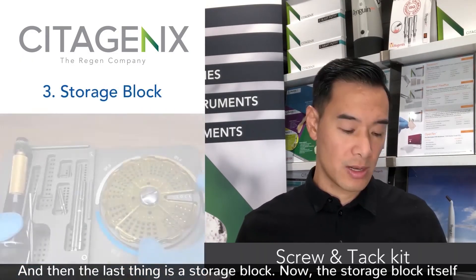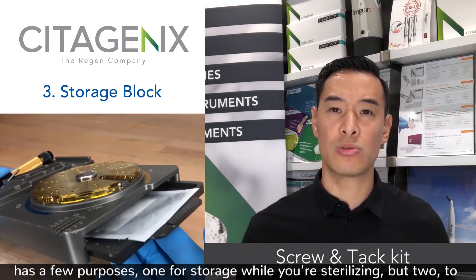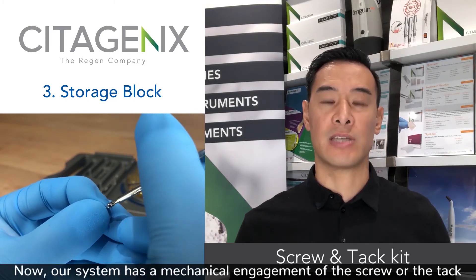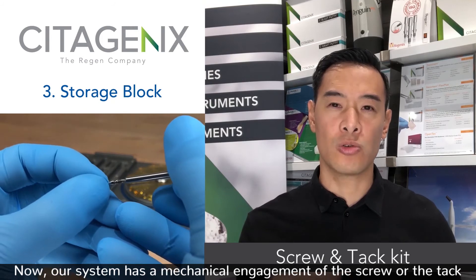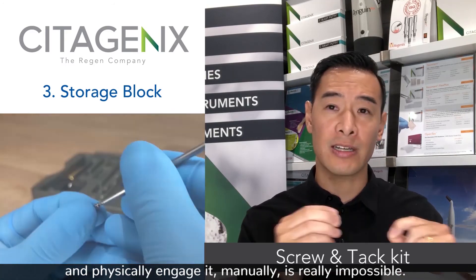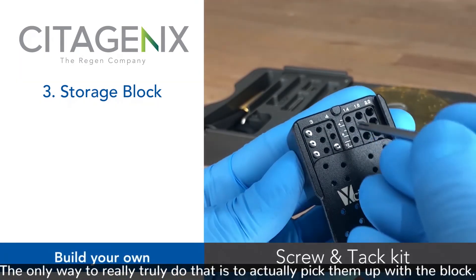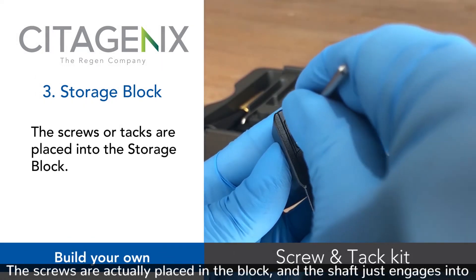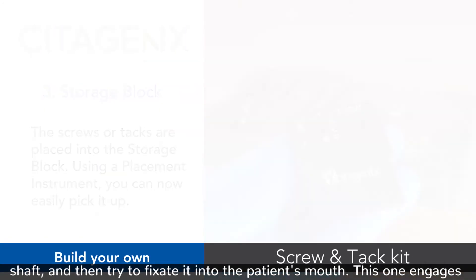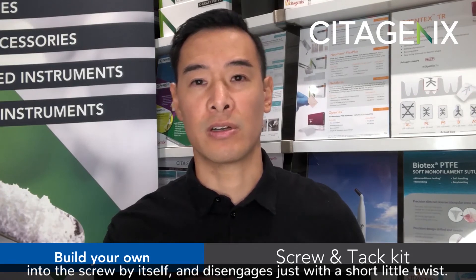The last thing is a storage block. The storage block has a few purposes: one for storage during sterilization, and two to pick up the screws or tacks in the middle of surgery. Our system has a mechanical engagement of the screw or tack, because trying to pick up a tack with your gloves in the middle of surgery and physically engage it manually is really impossible. The screws are placed in the block and the shaft just engages into the screw, so you're not having to hold the screw and the shaft simultaneously. It engages by itself and disengages with just a short little twist.